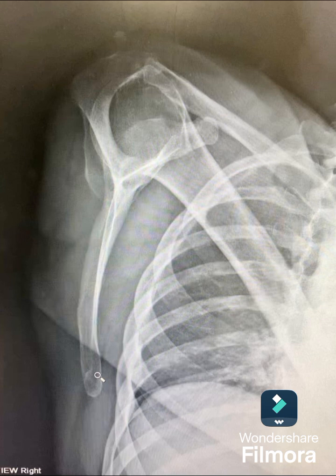You'll see a lot of technologists debate the arm position in these views. If this is a true lateral scapula, you would like to see the image with the arm out of the direction of the scapula. However, for a shoulder view, it's not really needed to be out of the way since it's really just for dislocation. Some textbooks say the arm needs to be pulled up; others say it needs to be left down to superimpose the scapula — it depends on your clinical area and what the doctor prefers. But for a scapula view lateral, the arm will be out of the way.